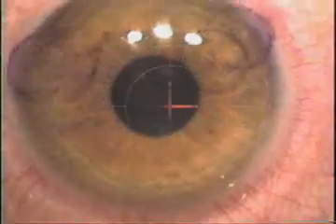It's actually created by the keratome. That's the engaging. It's moving. You can actually see the little gear track. See it moving? Okay, it's done. Okay? And basically 6 seconds up, it's done, backs off. The flap is now finished. Now, when we lift it away, I would like you to tell me where the flap is, because I can't see it, but it's there.